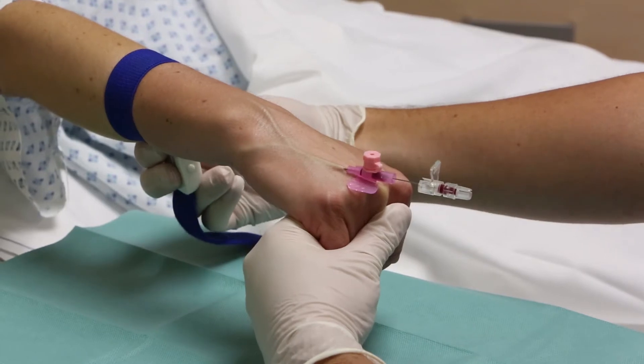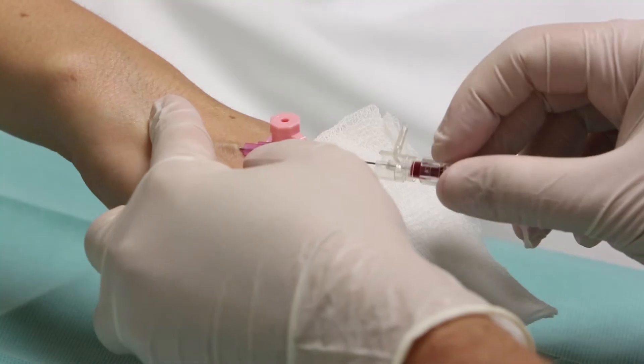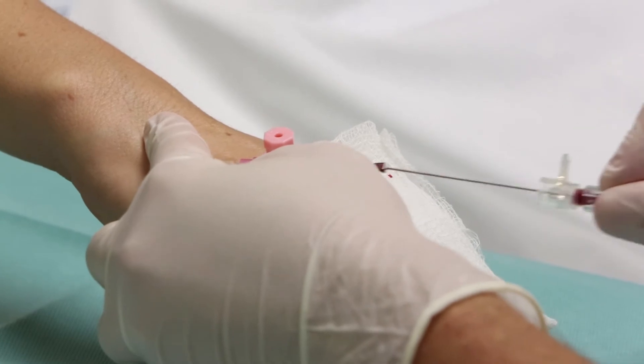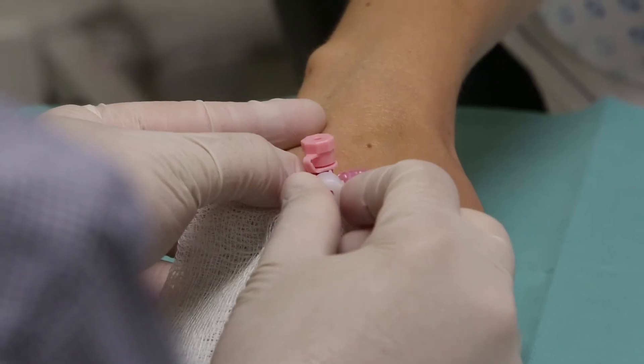Step 12. Ensure there is back flow of blood in the stylet. Remove the stylet and dispose immediately in the sharps box. Screw on the stopper.